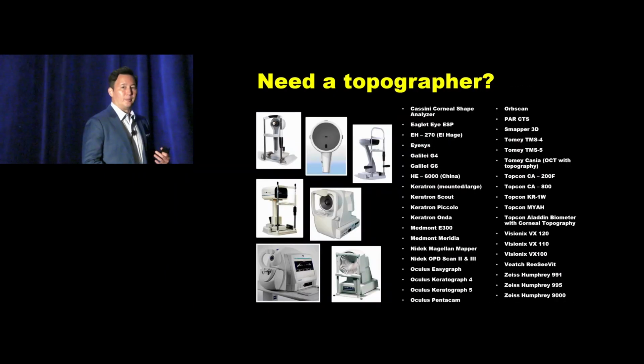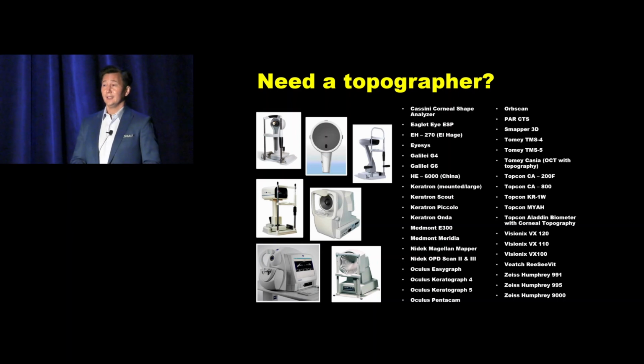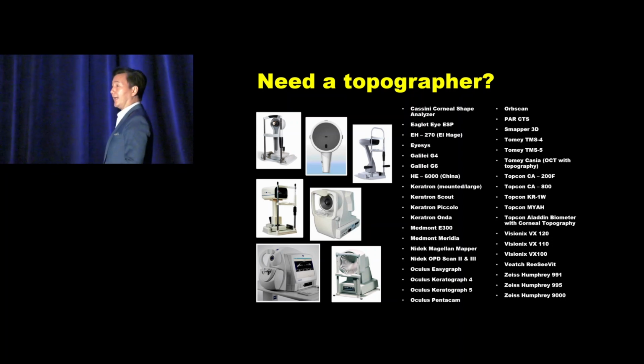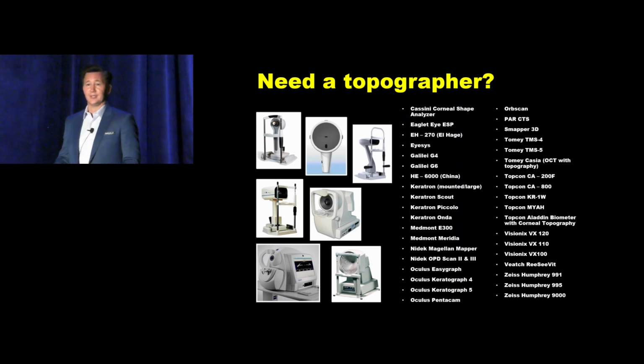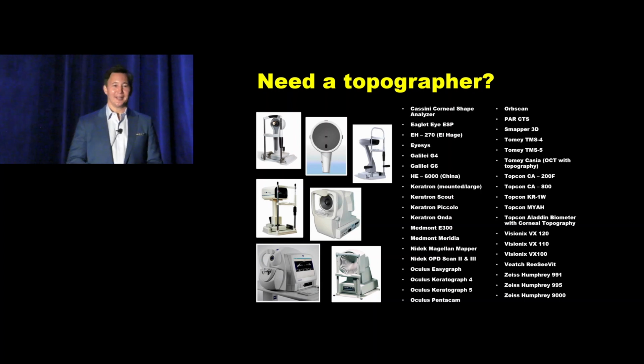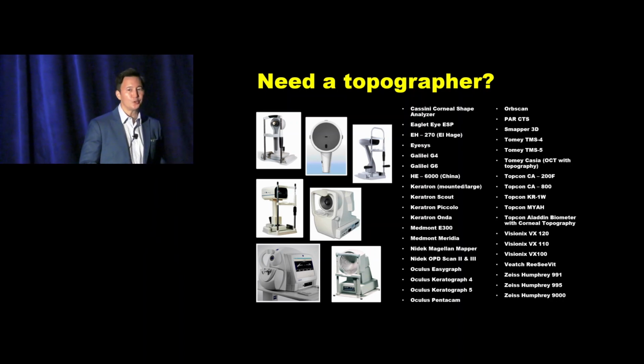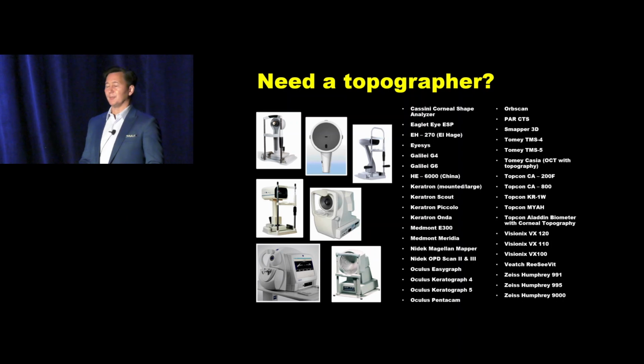Now, if you're at boot camp, I'm assuming many of you are new to ortho-k. Maybe you haven't even started in ortho-k. You need to get a topographer. And the story is any topographer is better than no topographer. So as long as you've got one, you're ahead of the game. You can consider topography to be essential instrumentation in this treatment. You've got to have one.